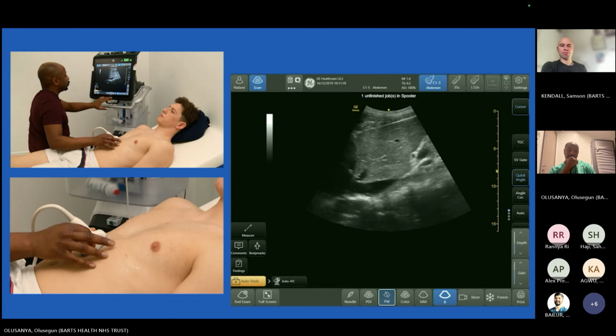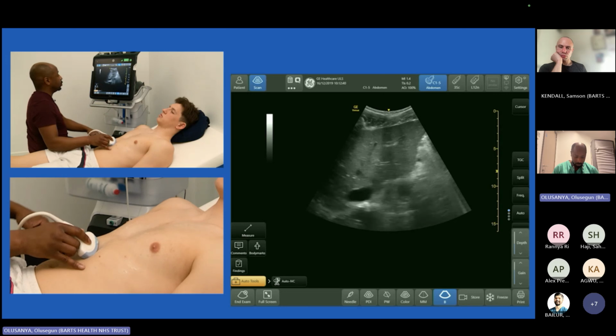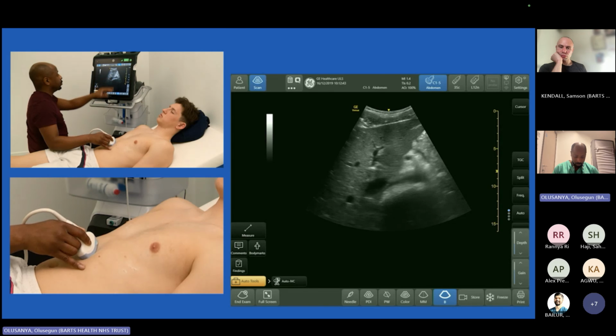Portal vein is easy to identify. It's surrounded by fat, so it has a nice thick appearance, as opposed to the hepatic vein, which isn't surrounded by fat, is thin, and connects to the IVC. There's the hepatic vein with the IVC. There's the portal vein. The other way of identifying the portal vein is when you put color on it. The flow is towards the transducer, so the flow in the portal vein is red. The one exception is people with severe portal hypertension, who may have reversal of flow in their portal vein. However, hopefully you'd have picked up some of this in the history.